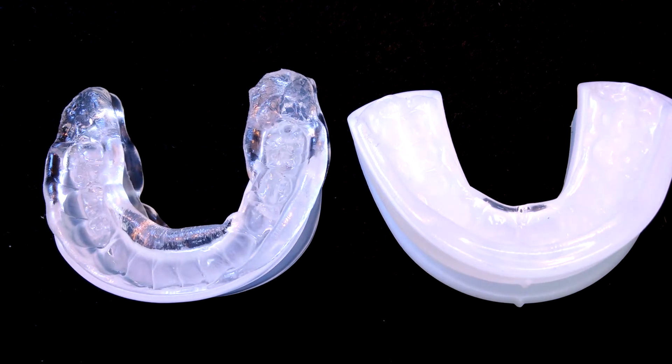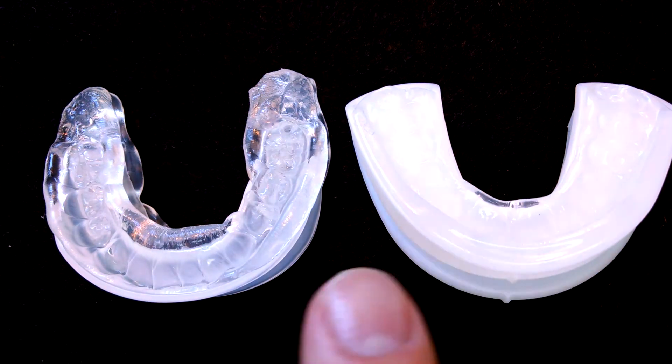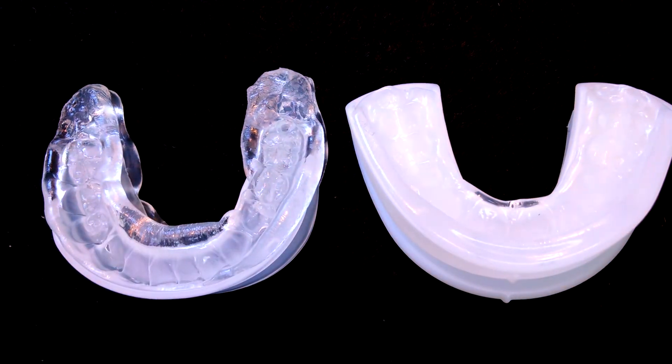Hey everyone, Bob Thomas from snorermouthpieceguide.com. Today I'm going to do a comparison video between the Sleep Pro Contour over here on the right and the PureSleep on the left. Both products are mandibular advancement devices, they're both designed to prevent snoring. Each one has its own unique features, so I'm going to show you those features and then we'll put them side by side and compare the two.